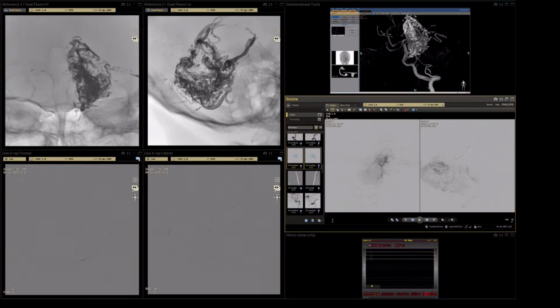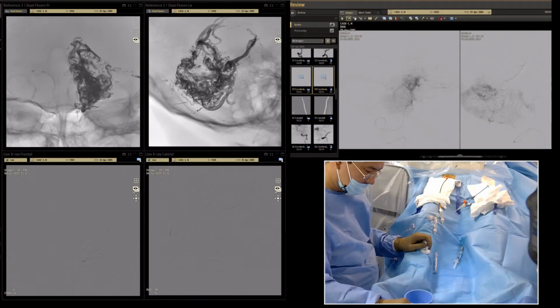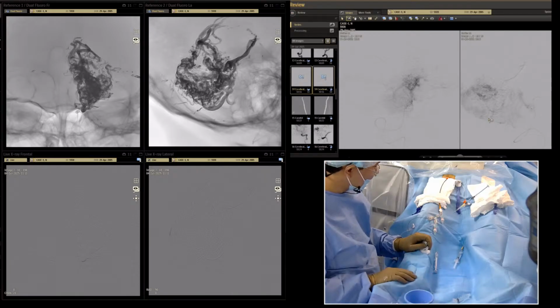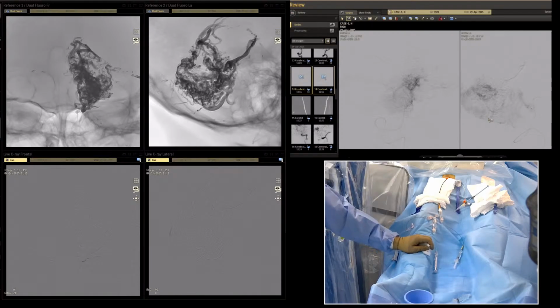Okay. We're waiting. We decided to shake the Squid and it's not so visible. It's teamwork. I'm waiting for the new portion of the Squid.